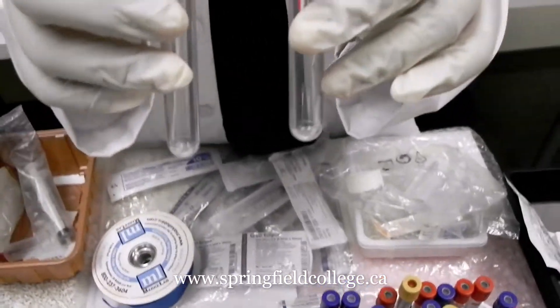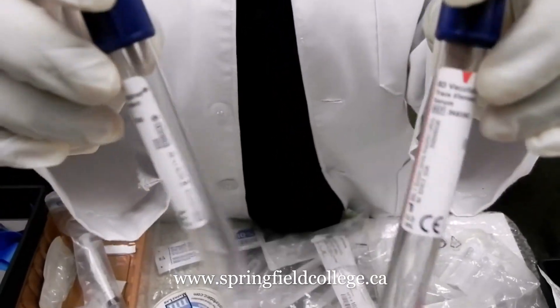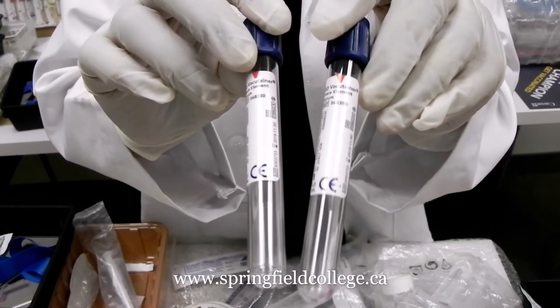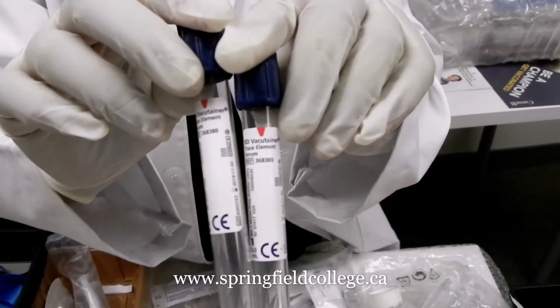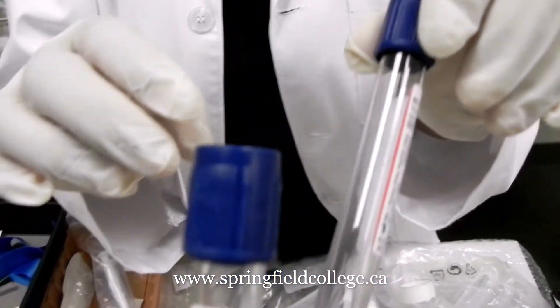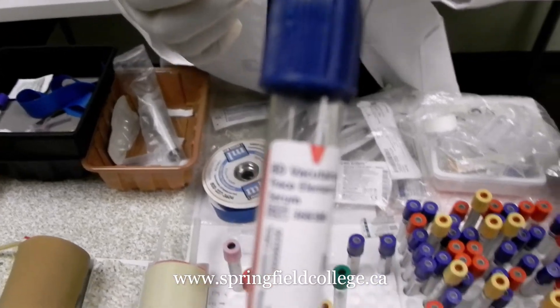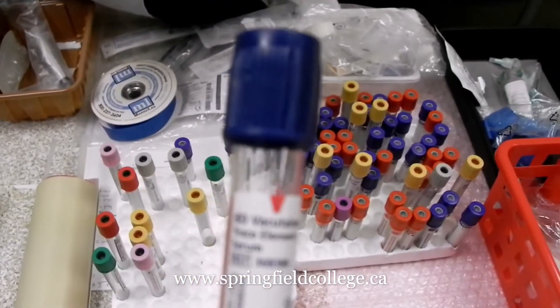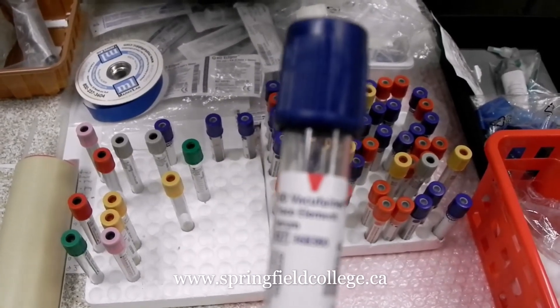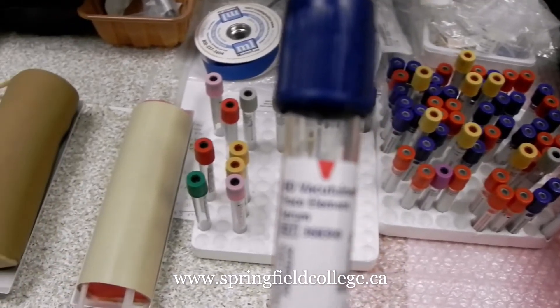We also have the royal blue tube. These are used for trace elements — so for metal toxicology. If somebody was exposed to metals like mercury poisoning or lead poisoning, we can use this tube. You can also see the mark on the tube indicating the fill level.